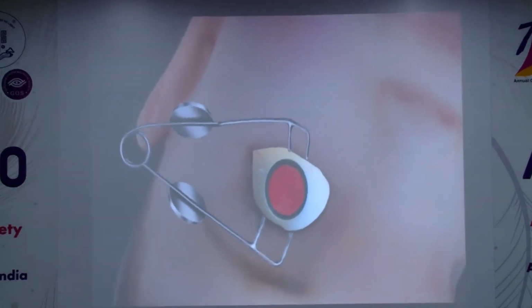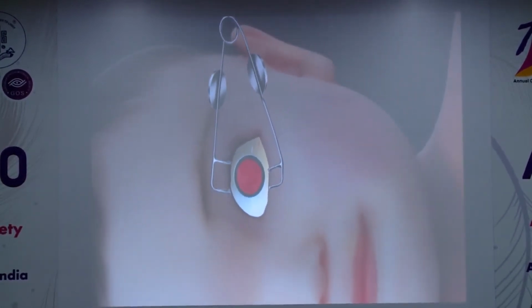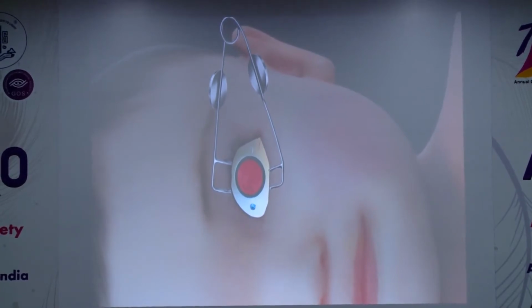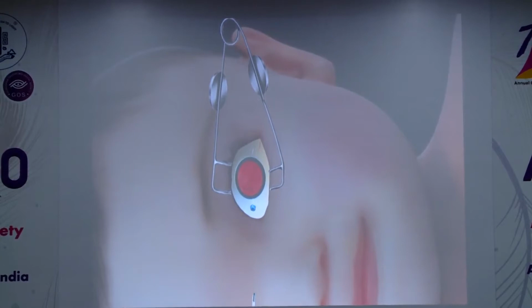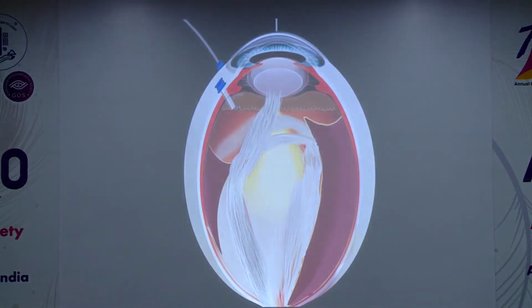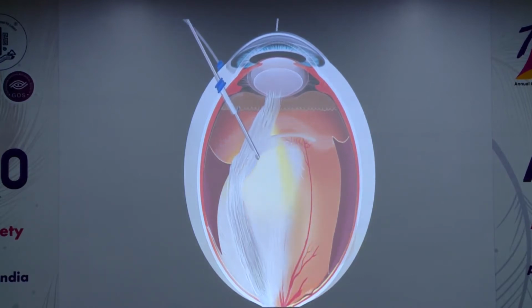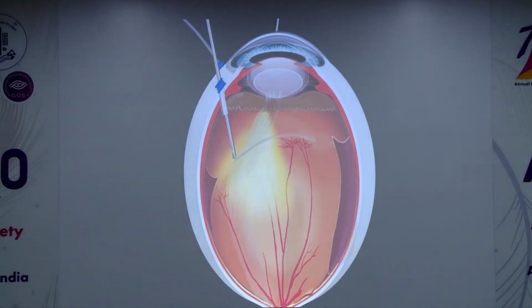We propose a novel all-nasal approach with the surgeon seated opposite to the eye being operated. The infusion cannula is placed centrally at the 3 or 9 o'clock position for the right and left eye respectively. The other 2 ports for the vitrector and endoilluminator are placed on both sides of this port. The rest of the principles of lens-sparing vitrectomy remain the same.